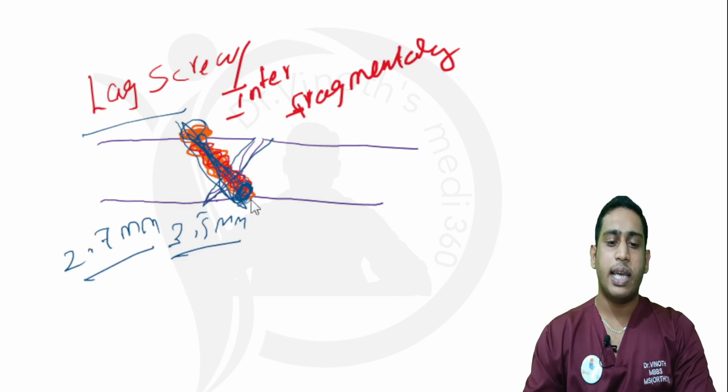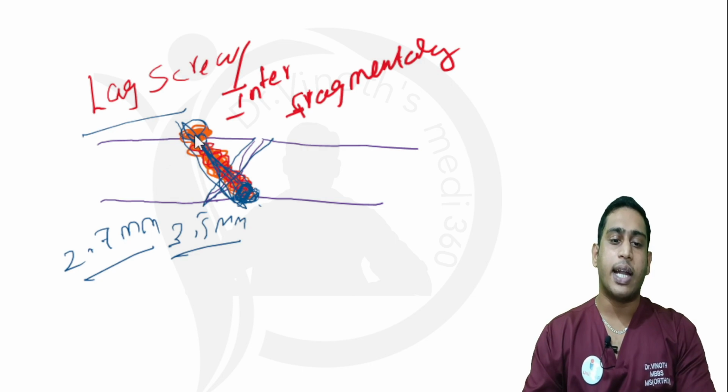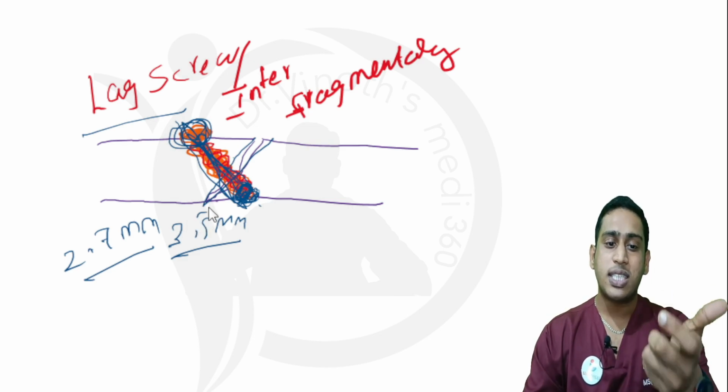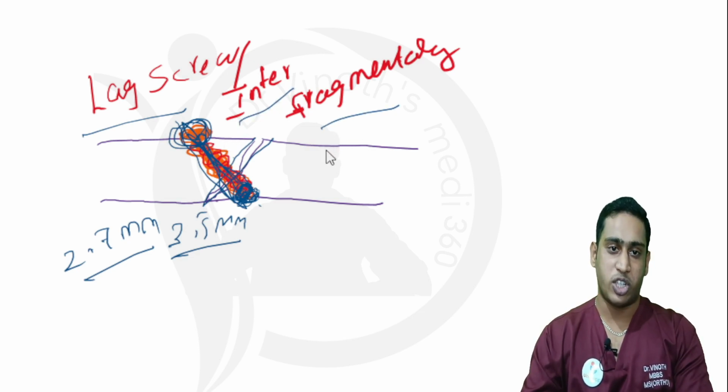So I will be drilling a 2.7 millimeter hole in the opposite cortex, or the far cortex. On the other hand, I will be overdrilling the proximal cortex, the near cortex. So once this screw passes through this hole, it will provide compression at the fracture site. This type of fixation is called lag screw fixation or interfragmentary screw fixation.